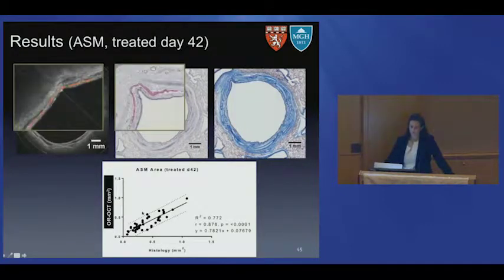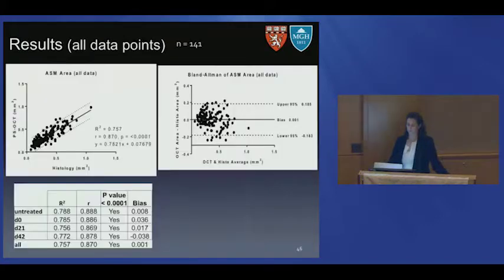But if we zoom in, you can better appreciate how thin this is. The thickness of the smooth muscle here was pushing 10 microns, which is really what we state is our resolution limit of OCT. So we were very happily surprised that we still managed to do a decent job in seeing the smooth muscle in these airways. In humans, as you saw previously, the smooth muscle is going to be much, much thicker, more on the order of hundreds of microns as opposed to the tens here.